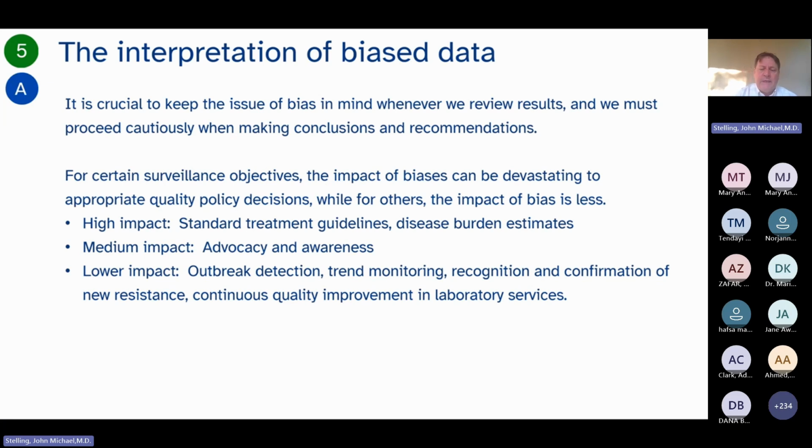If you have a VRSA, it's usually going to be due to a mistake in the identification or in the susceptibility. If you do good quality susceptibility testing, there are not that many variables. There's the disk diffusion, there's the disk, there's the medium, there's the inoculum. But with organism identification, there are many additional variables. It requires the knowledge of a trained microbiologist with flowcharts. It requires oxidase and catalase and all of these other tests. So in a place that does relatively good susceptibility testing, strange results are often due to a mistake in the identification.